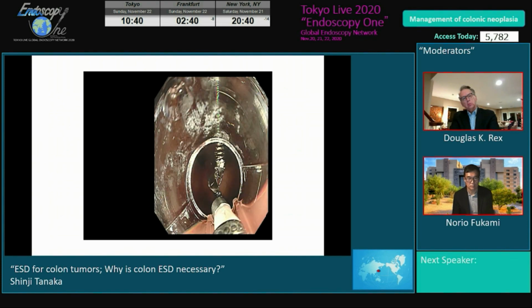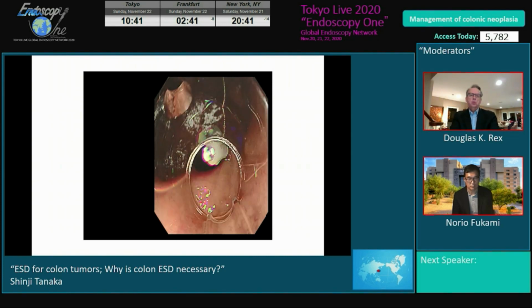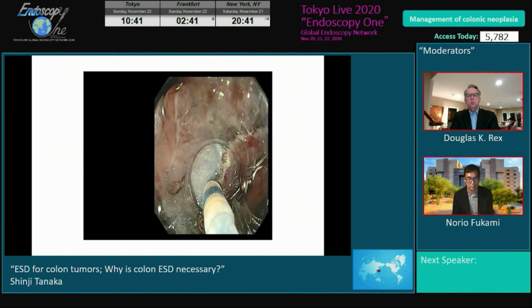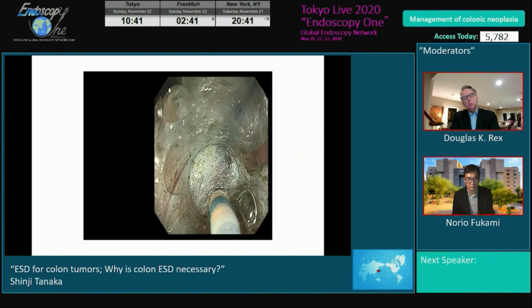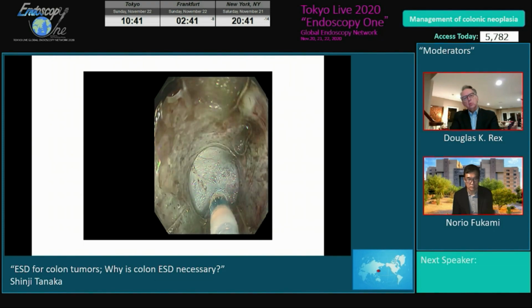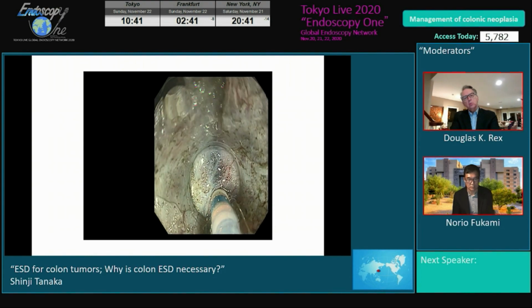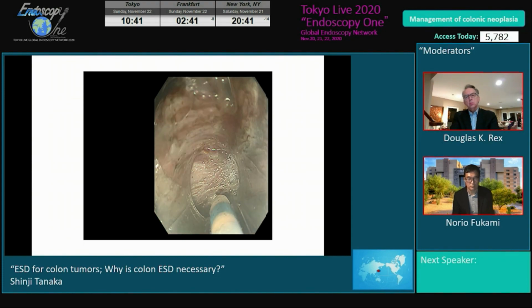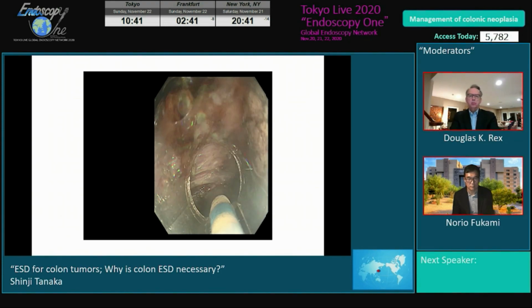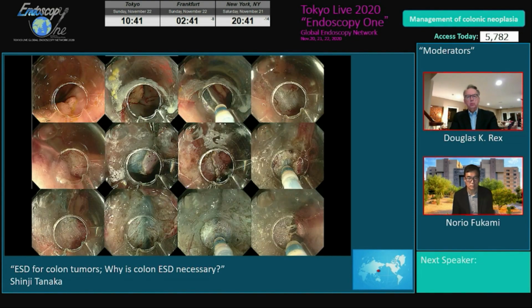Now we grasp the region edge by SO clip, then catch the small ring of SO clip by another clip, then fix the opposite side to the region, then restart the submucosal dissection like this. SO clip offers good visuality of submucosal layer, and we can dissect like this safer and easier, even with severe fibrosis. These are the procedures of ESD of this case.